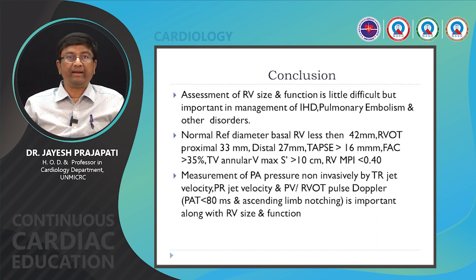RA function assessment is also important. We have to see that the IVC gives a rough, crude idea of the volume status of the patient, and of course the RV wall thickness should also be assessed.